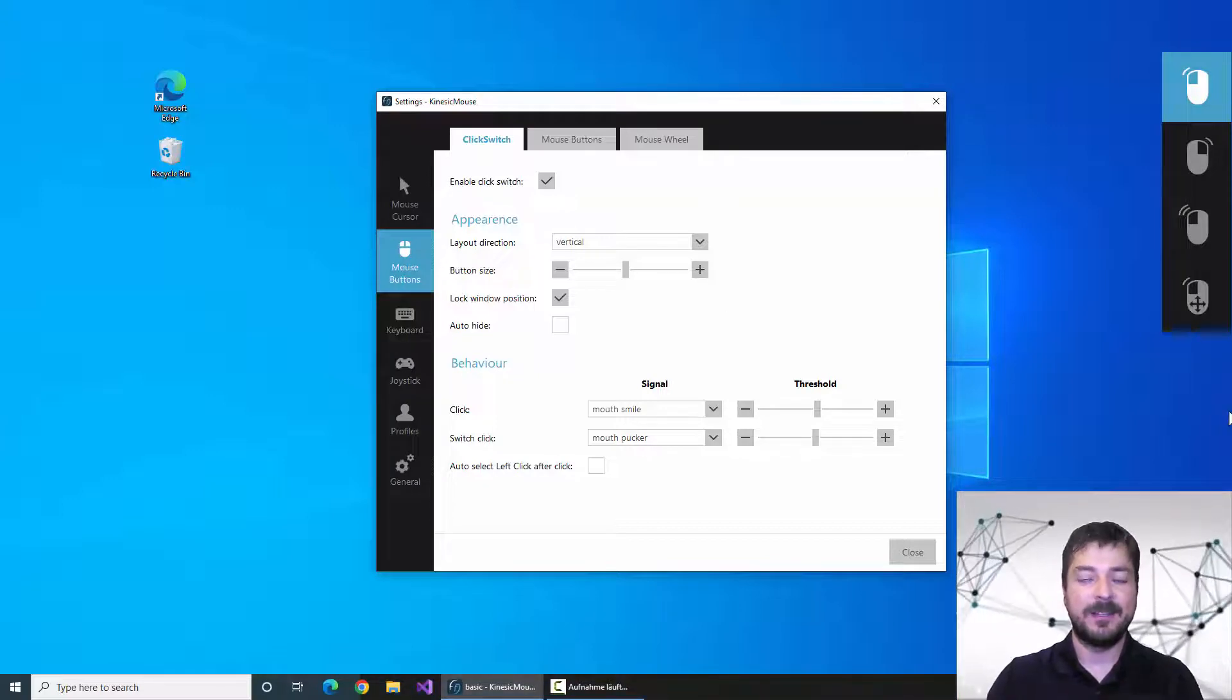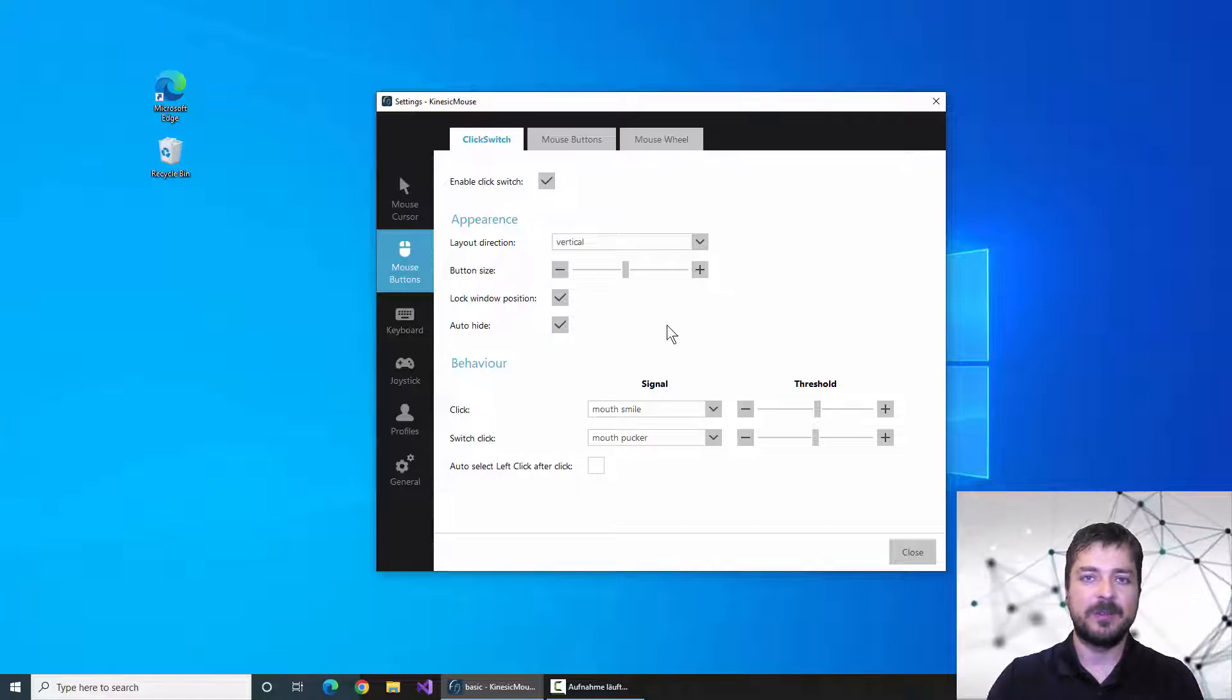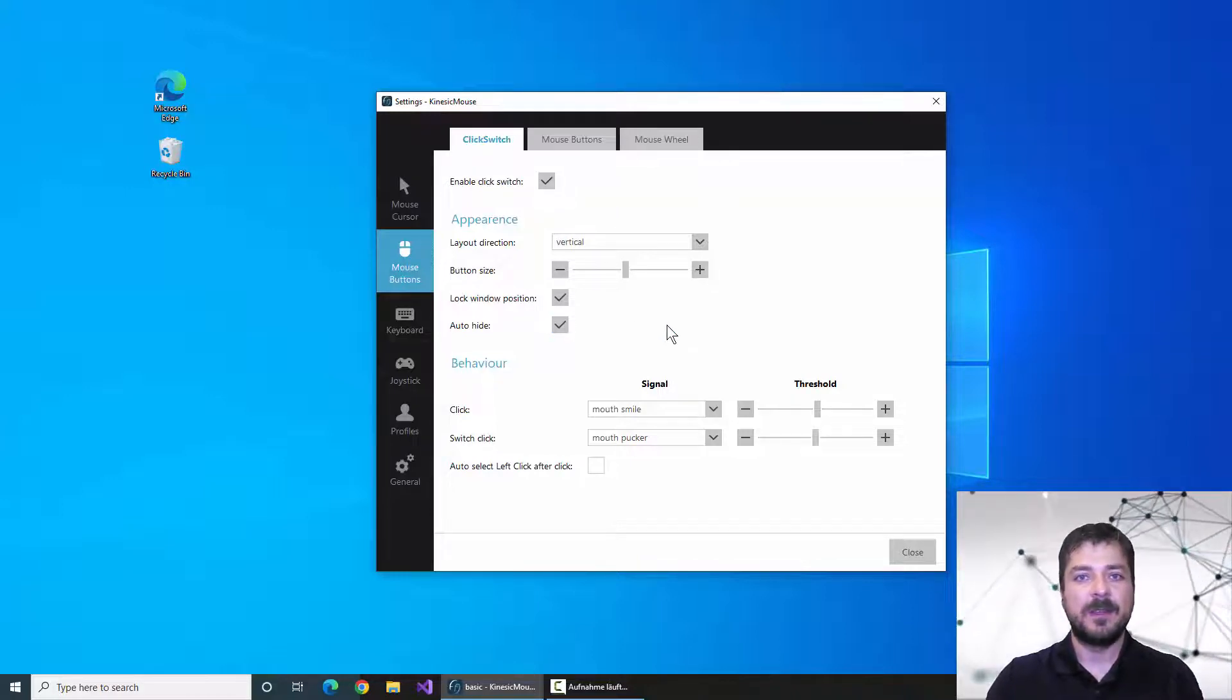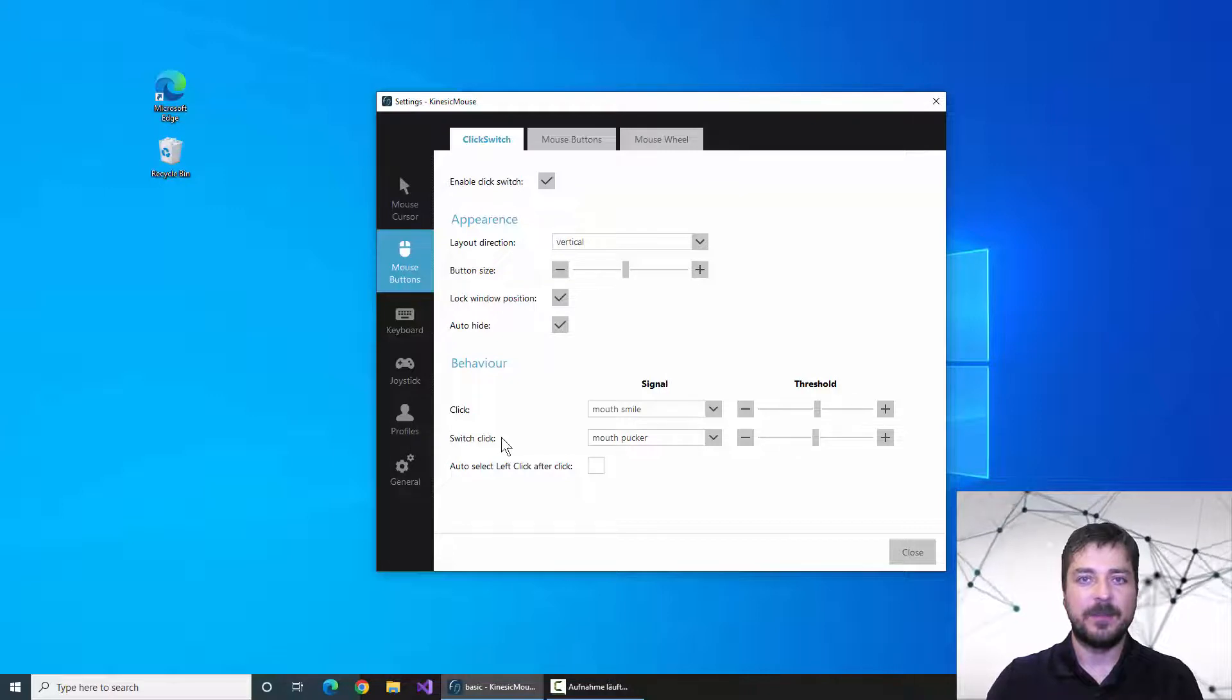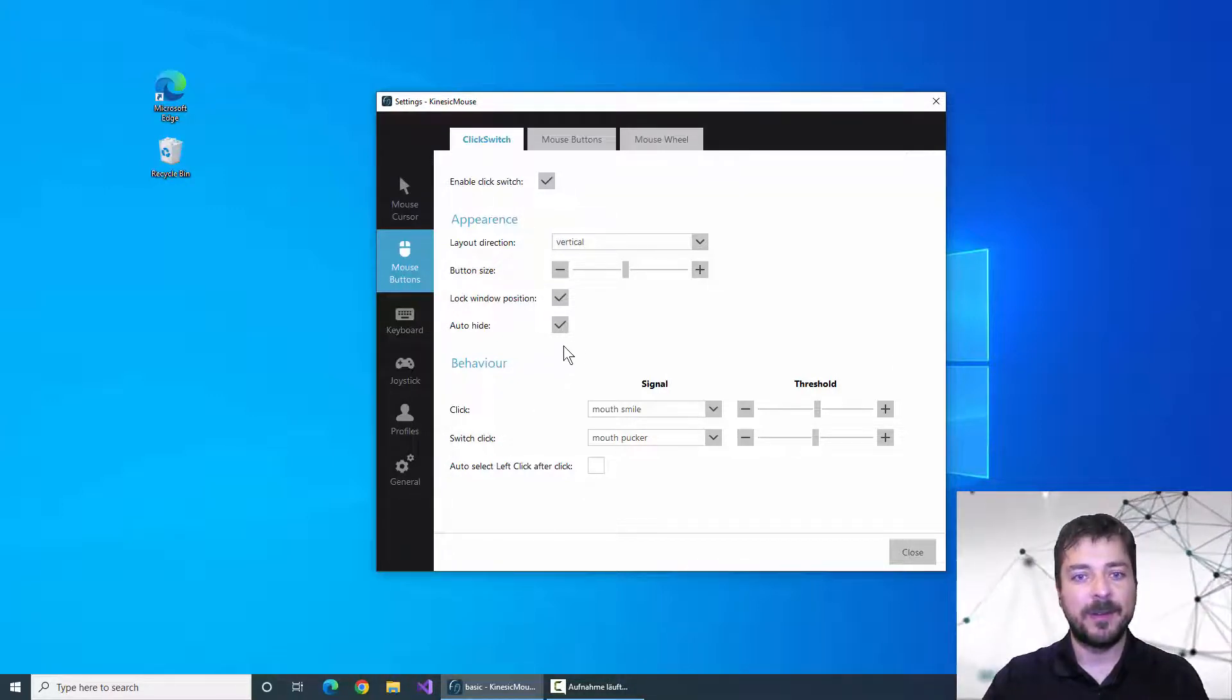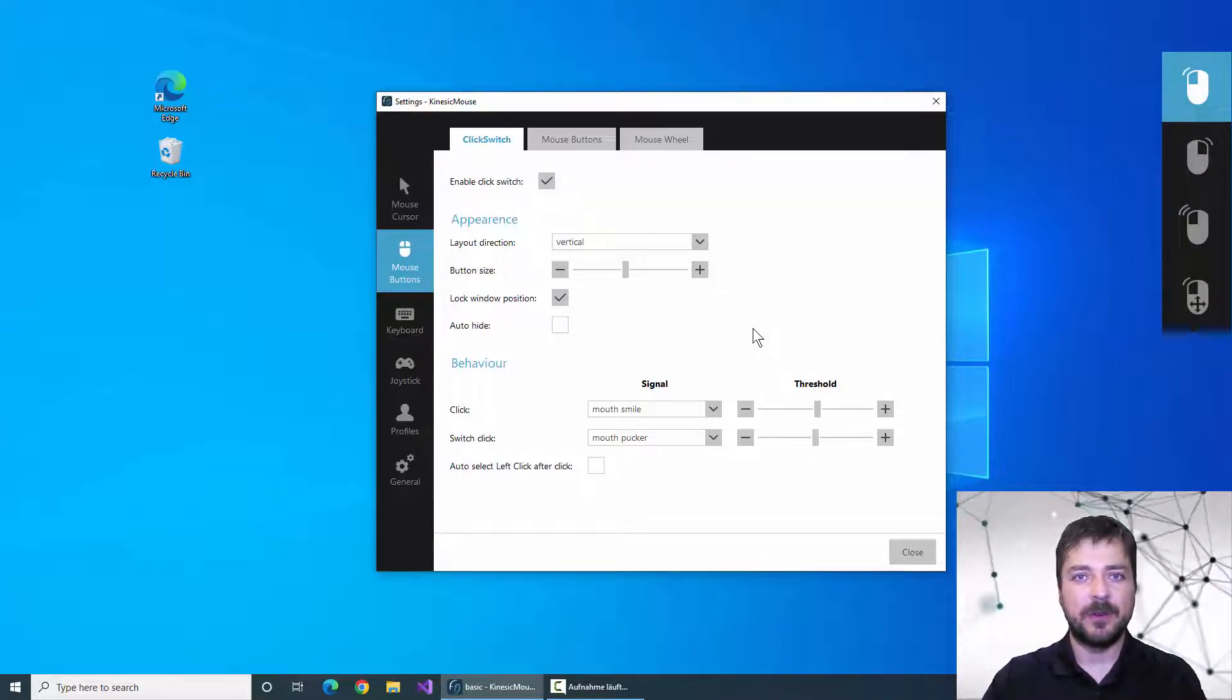And finally we have the auto hide feature. If you select this checkbox you will notice that the menu disappears. The buttons will only be visible while switching through the mouse button types using this signal down here. We will see that later in the video. For now I will leave that auto hide feature off to see what's going on.